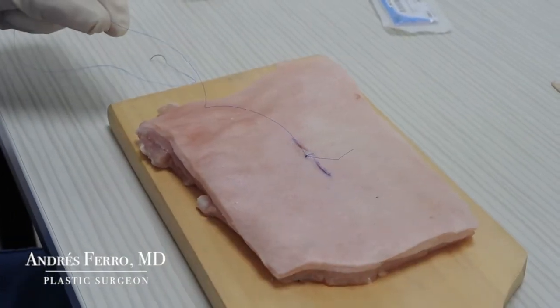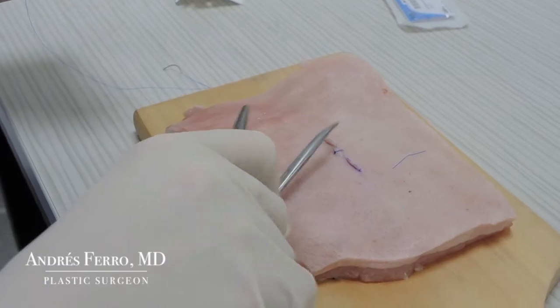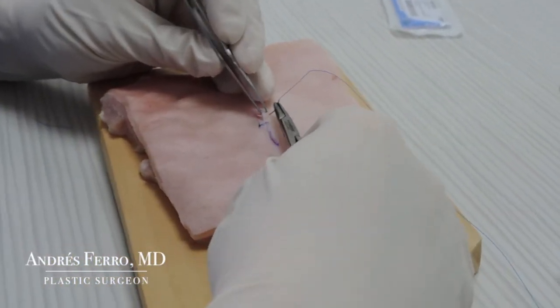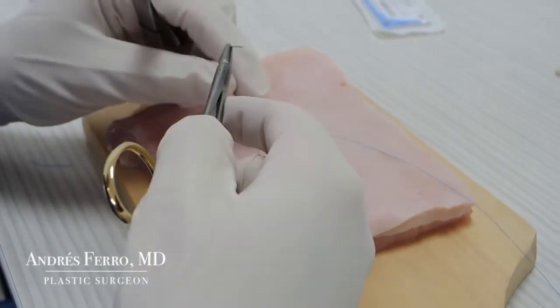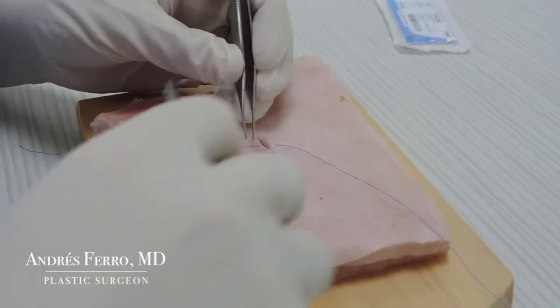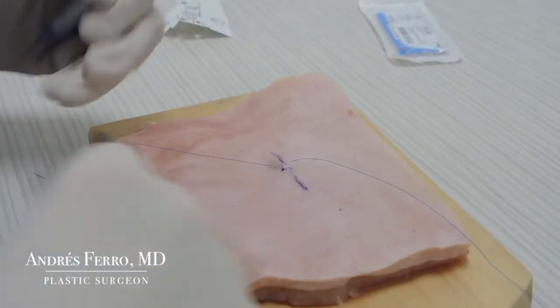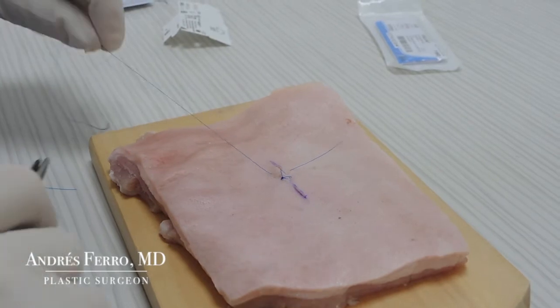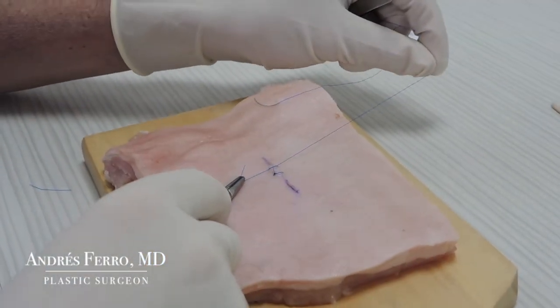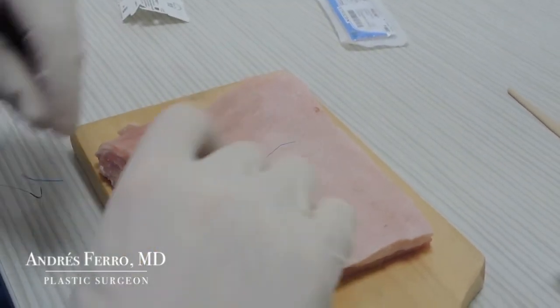Now cut the suture and continue in the same way, doing simple stitches, entering high through the highest edge of the wound and lower on the lowest or depressed edge. Knot the suture in the same way and continue doing stitches throughout the whole wound until leveling it correctly.